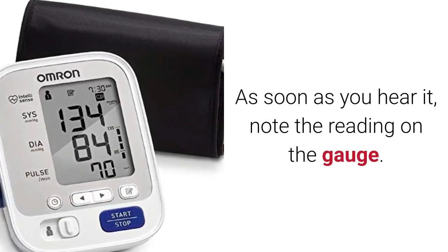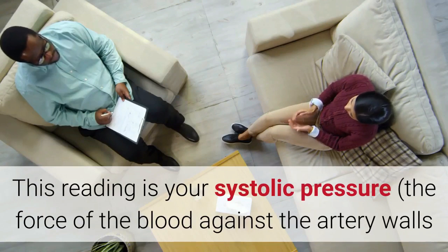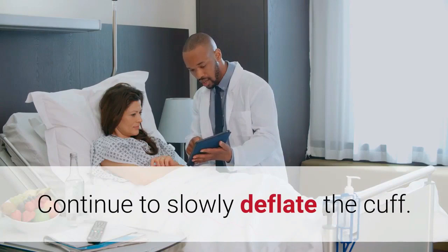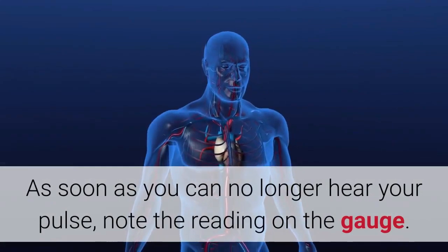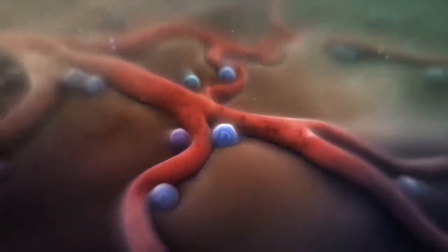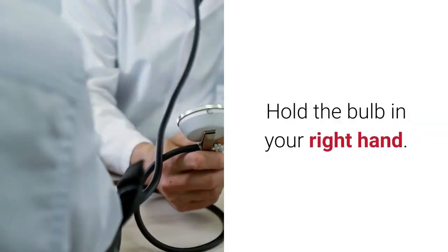Listen carefully for the first pulse beat. As soon as you hear it, note the reading on the gauge — this is your systolic pressure, the force of the blood against the artery walls as your heart beats. Continue to slowly deflate the cuff and listen carefully until the sound disappears. As soon as you can no longer hear your pulse, note the reading — this is your diastolic pressure, the blood pressure between heartbeats. Allow the cuff to completely deflate.